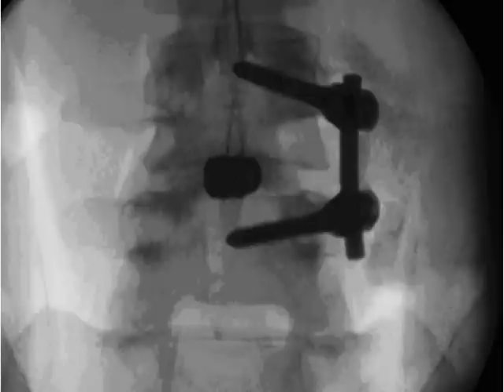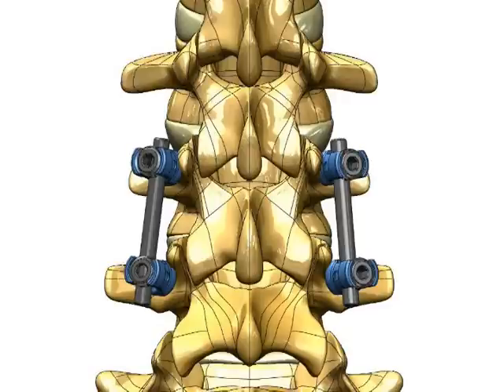If the indication requires, the surgeon may add a bilateral screw and rod construct to the opposite side of the spine. This can also be accomplished using the Marquise MIS channel with an additional small incision.